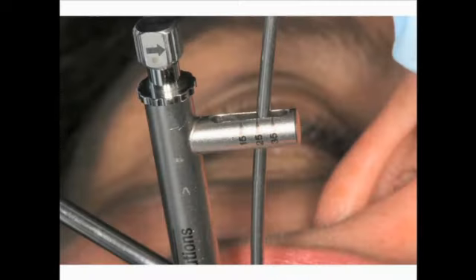The tightness of the implant in bone is checked using a torque ratchet. These record torque of 15, 25, and 35 Newton centimeters. We easily achieve 25 Newton centimeters of torque on this implant in the maxillary right first molar area. Once this level of torque is achieved, we can either use a cover screw or a taller healing abutment can be safely placed into the implant to allow for tissue healing.